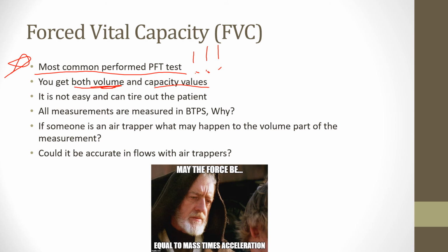It's not easy, and the patient can get really tired out from doing this procedure because you're having them take a super deep breath in and then forcefully, as hard and as fast as they possibly can, blow out. It's a really big effort. You're screaming at them. Everybody in the next room is wondering why you're screaming at that patient in there. And you're really trying to get the max effort out of someone.